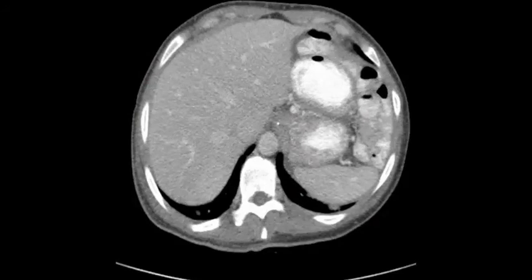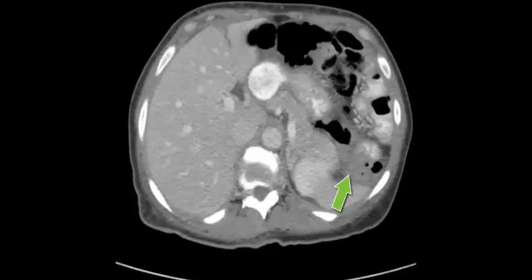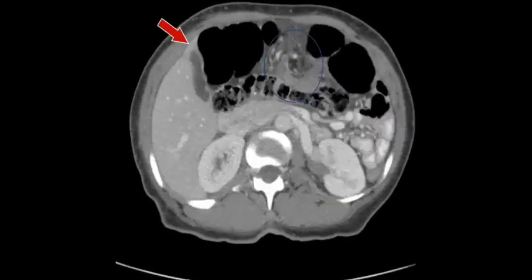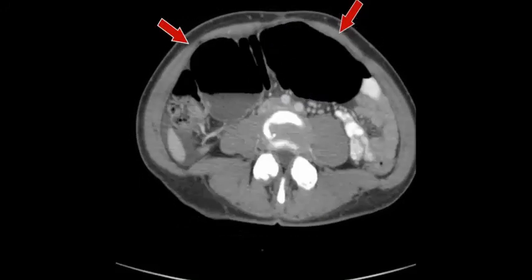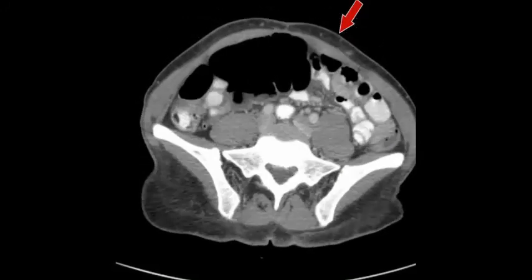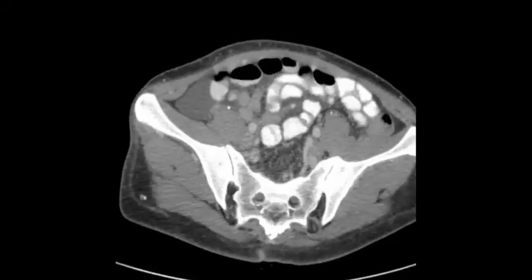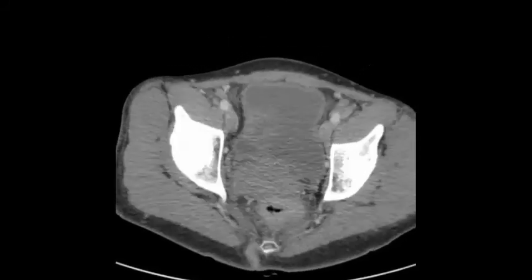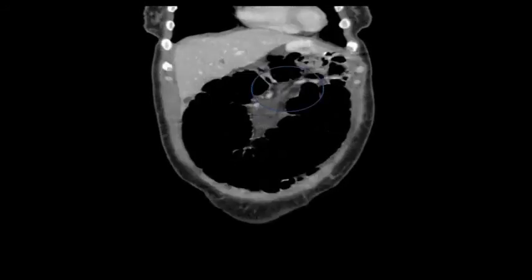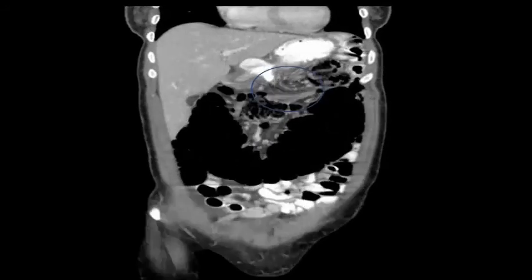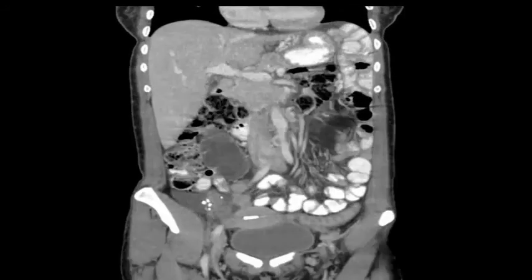Here's the cine loop again starting with the collapsed splenic flexure and the dilated more proximal transverse colon with the mesenteric twist, compatible with transverse colon volvulus. The coronal view highlights how helpful reformatted images are to piece together the anatomy, clearly showing the twist of the mesentery at the large bowel transition point.